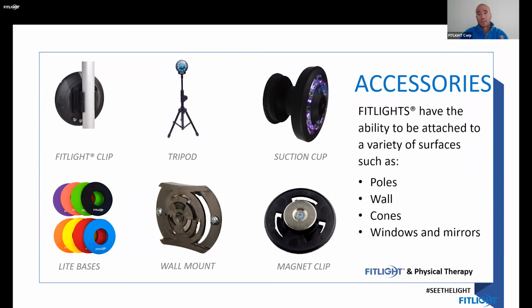Okay, mind you, the whiteboard is a good idea. It needs to be a whiteboard, obviously, that is magnetic. Not all whiteboards are magnetic, and I believe that there's also different grades of how strong the whiteboard would be. So please check before you buy one of the magnets.